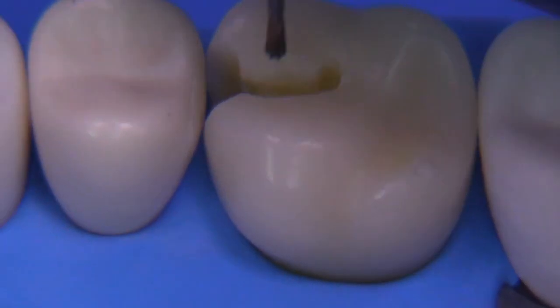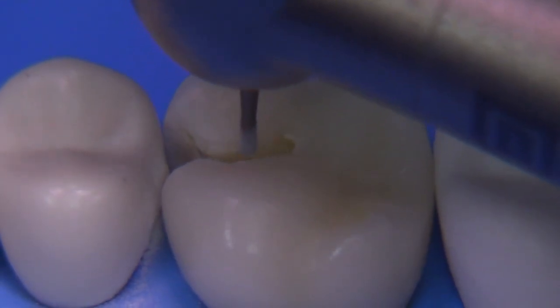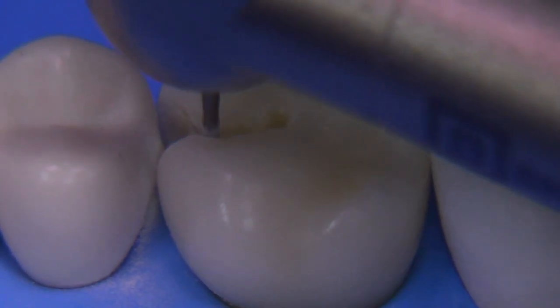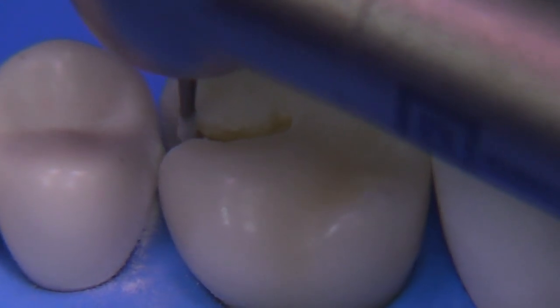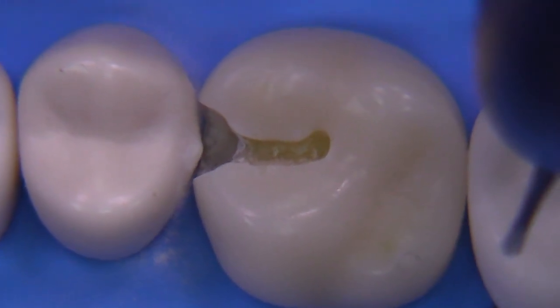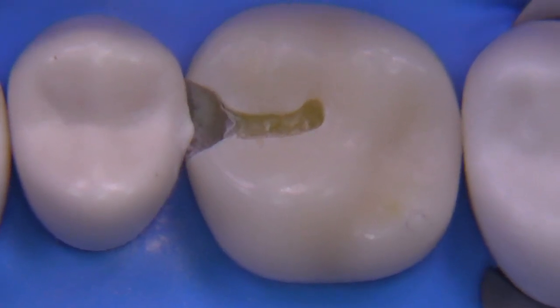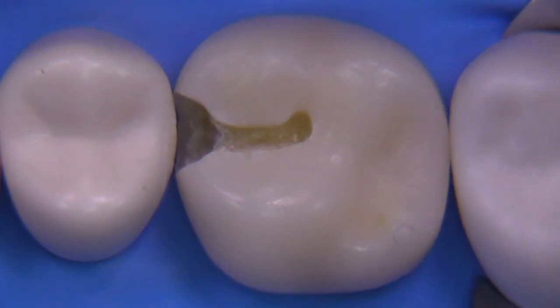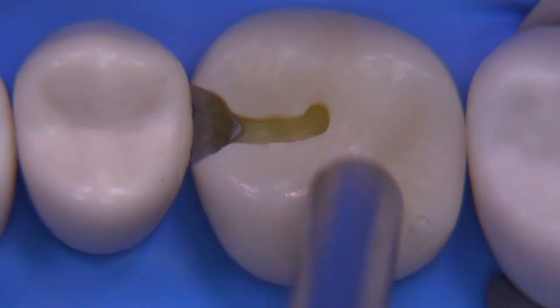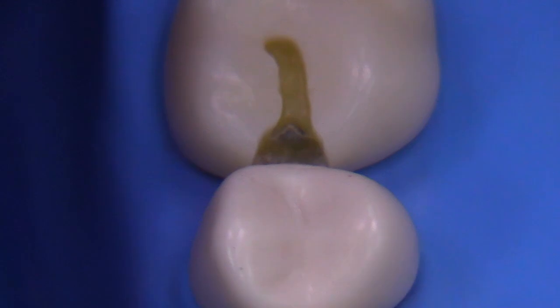Back to refinement — this is the RGS 330 bur, which is specially designed to enhance the internal smoothness and the outline form of all class 2 and class 1 preparations. We're using this here to create a smoother outline form. We have not yet concerned ourselves with the axial caries and the pulpal caries at that axial-pulpal line angle, but gosh, that looks so realistic to me — it's pretty nice.